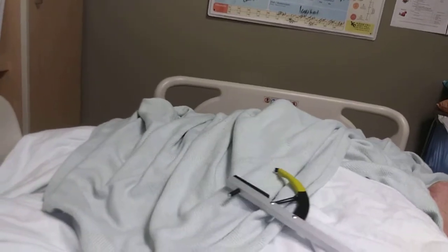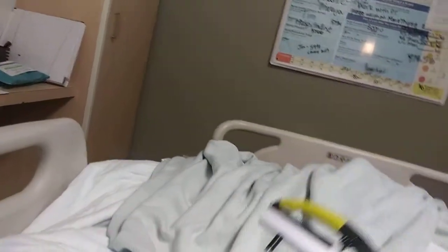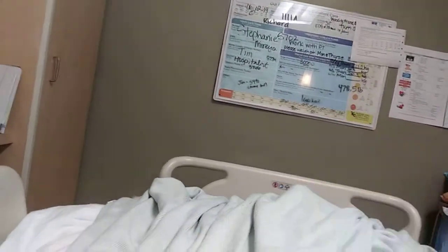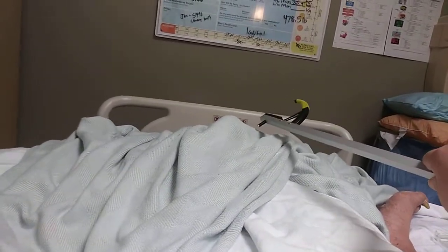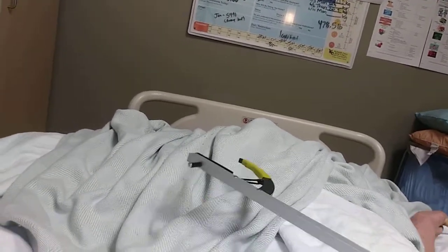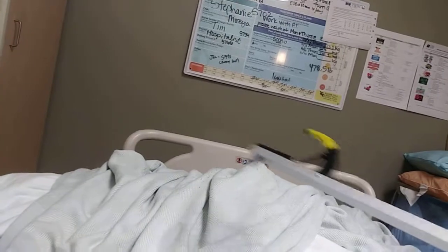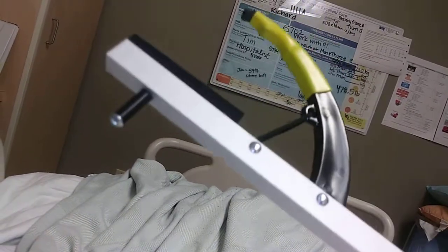I forgot to tell you that this thing with the screw in it, sticking out of the back side of this, is also to help when you're dressing. You put it down to wherever you can grab your pants and pull them up your legs to where you can reach them and pull them on the rest of the way with your hands. That's to grab your clothes and bring them up towards you. Sometimes that won't work because it's too slippery, because it's just hard plastic with a screw, and things will slide off that.